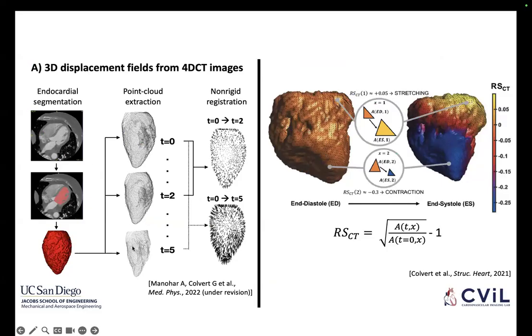We do this for each time frame. And so here's the beginning, or end diastole, at time frame 0. As the ventricle contracts, we use deep learning to segment out the blood volume in the chamber. And then we get these vector fields that move this surface onto one, say at time 2, is this vector field, onto time 5, is this vector field. And so now we'll have a mapping of that, and then encode how an area patch changes at a given spot, at time t.